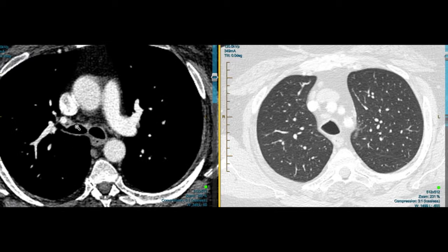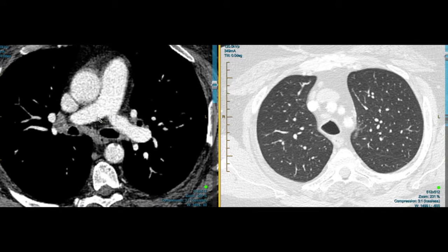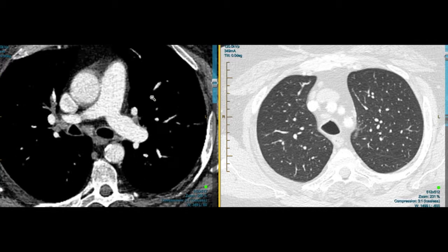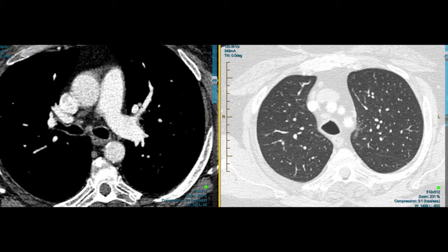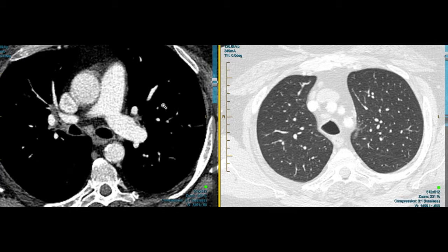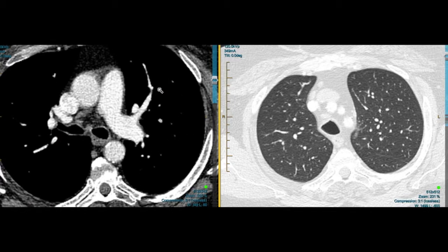As we scroll down further, we get to the right main bronchus and the right upper lobe, and just below the right upper lobe take-off, there seems to be a soft tissue lesion here, which I suspect is the right hilar lymph node, with the pulmonary artery coursing across the top of that. As we scroll back up, we can see that the anterior segment of the right upper lobe coming off here seems to come to a brief, abrupt ending, possibly with some soft tissue just in here.